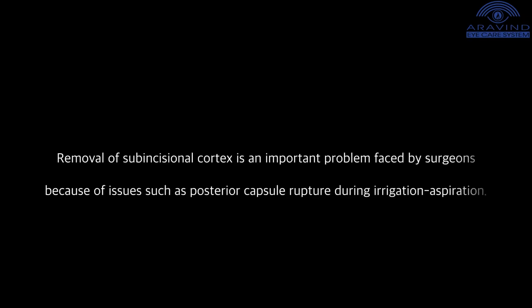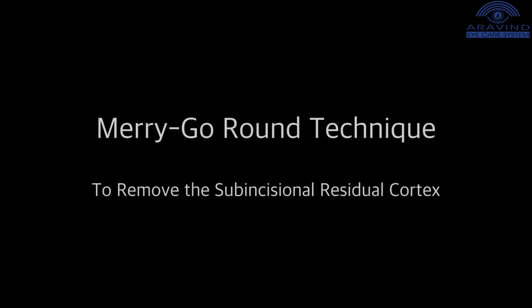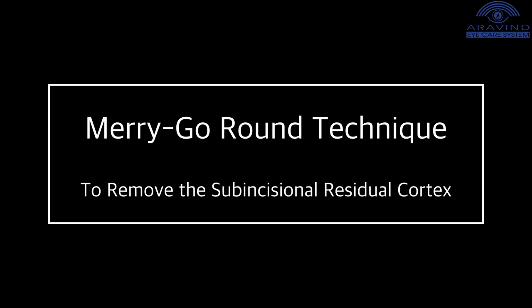Removal of subincisional cortex is an important problem faced by surgeons because of issues such as posterior capsule rupture during irrigation aspiration. We introduce a simple merry-go-round technique to remove the immobile subincisional cortex.